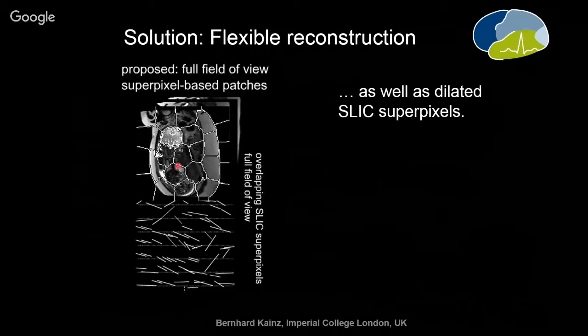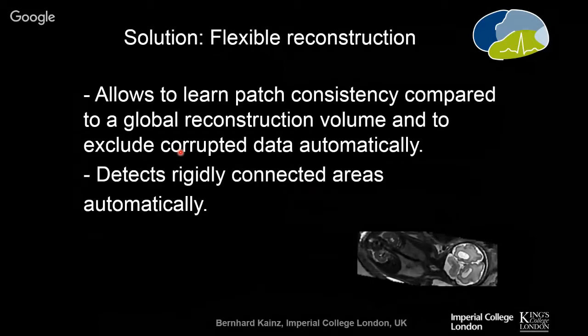I mean, this is, of course, a showcase example. So if you look at this superpixel, it contains already the whole brain and nicely fits to the skull, and can be used directly to reconstruct the brain. But even if this would split the brain into two, it wouldn't matter, because they would also just move consistently through the registration. And this is also something we can actually use to estimate areas of bulk motion.